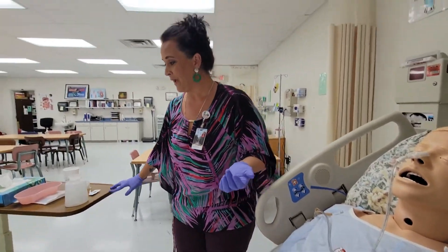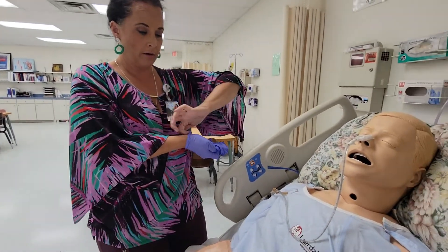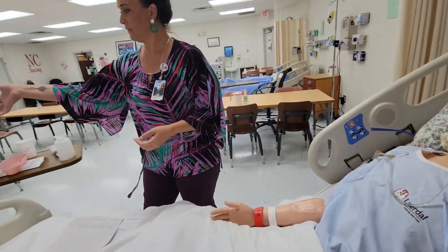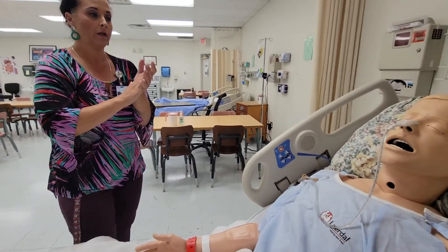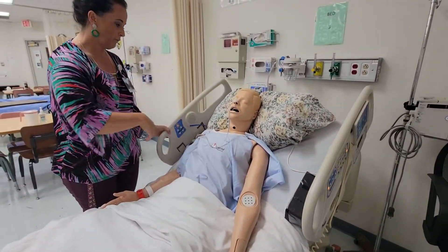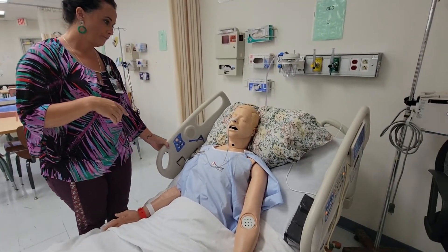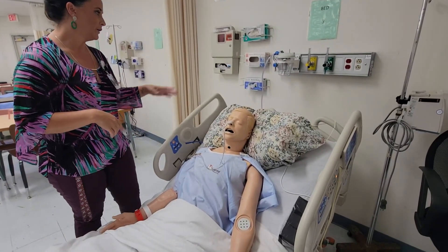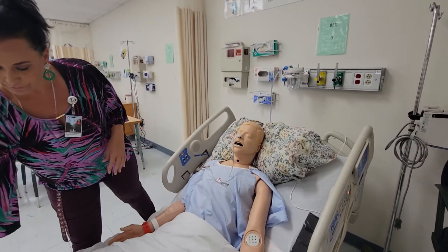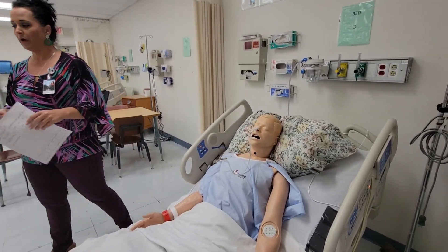Ask your patient how they're feeling and make sure they're okay. Take your gloves off and do hand hygiene. Ask if you can get them anything. Lower your bed, side rails up, call light within reach. Note the amount that's draining and the color and consistency. Hopefully this is helping them out and making them more comfortable. Take all your supplies and leave — document your findings.